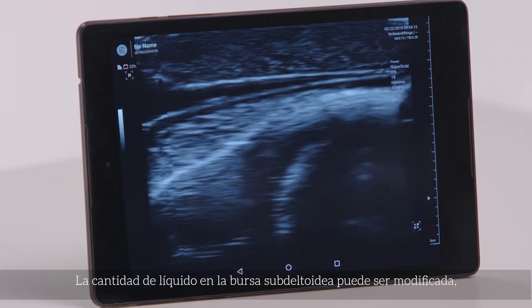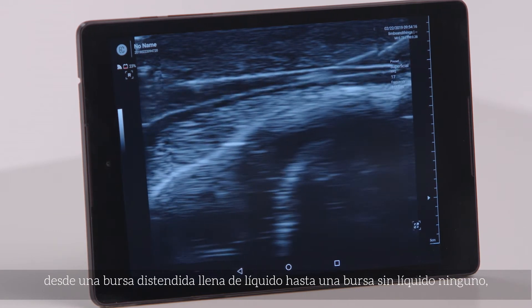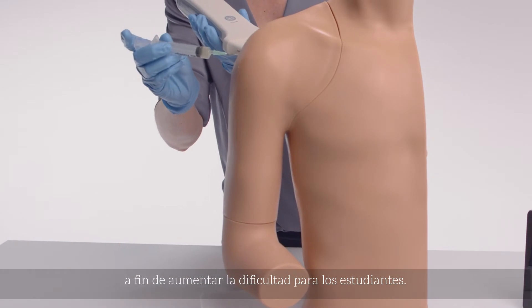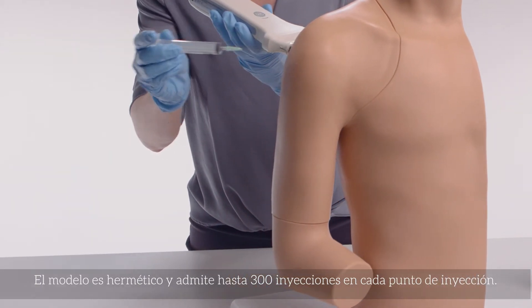Trainers can alter the quantity of fluid in the subdeltoid bursa, from fluid-filled distension to no fluid, to increase the challenge to trainees. The model is watertight and can withstand up to 300 injections per site.